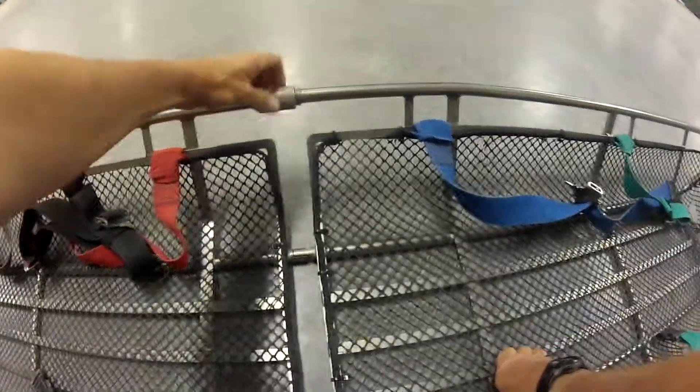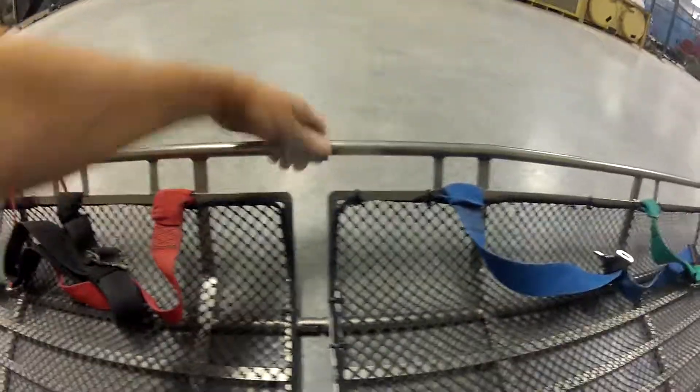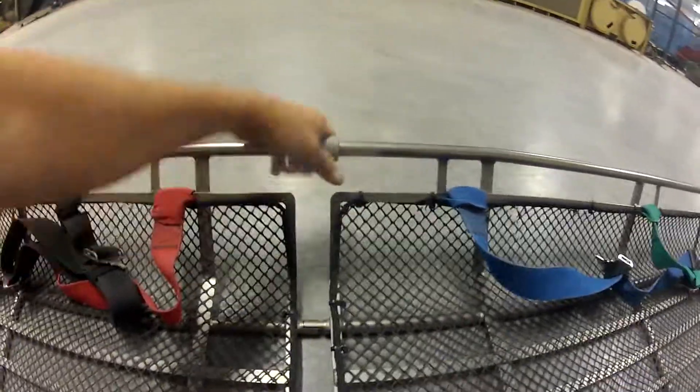Go all the way in — same with this one. Go all the way in there, all the way tight.